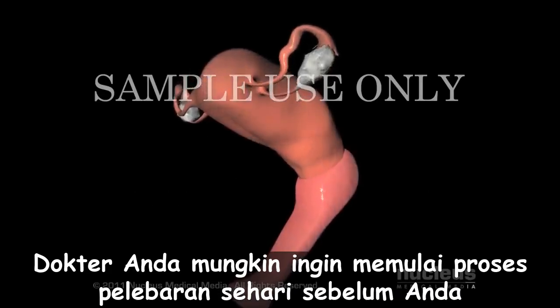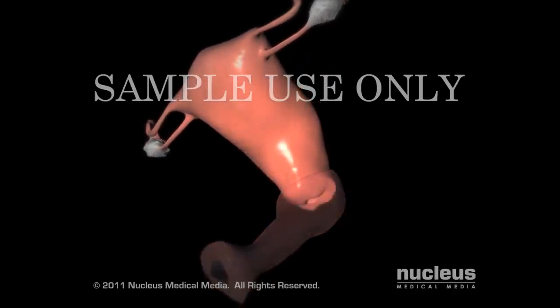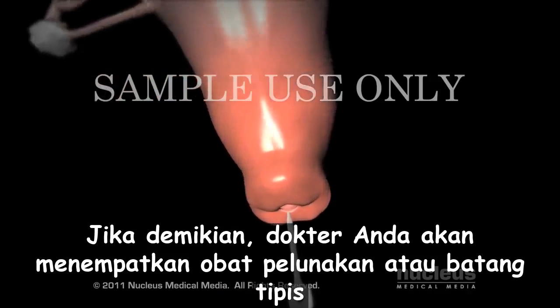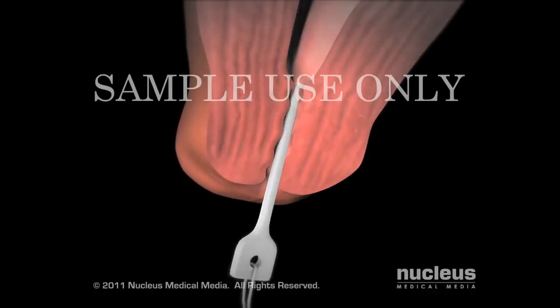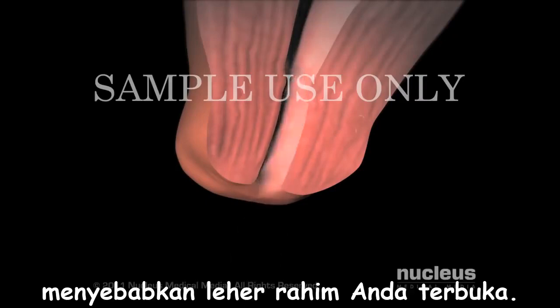Your doctor may want to begin the dilation process the day before your procedure. If so, your doctor will place a softening medication or a thin rod called a laminaria into your cervix. The laminaria slowly expands by absorbing fluid from your cervix, causing your cervix to open.